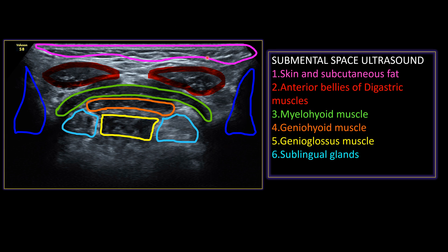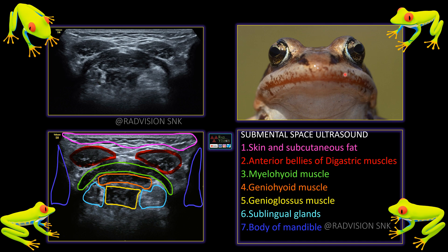We will compare with the actual frog face so you can clearly understand all the components of the submental space that mimic the frog face view. Both eyes of the frog are depicted by the anterior belly of the digastric. The mouth outline is the mylohyoid muscle. The superficial floor of the mouth is the geniohyoid, the deep part is the genioglossus, and laterally the bulgings are the sublingual glands, with the shadows on either side being the body of the mandibles.